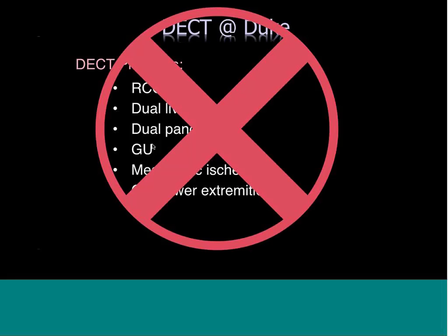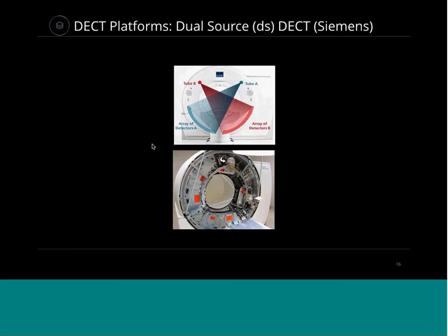My philosophy is, if you believe in dual energy CT, you better do it on everything. Either you believe it or you don't. Either it adds value or it doesn't. If it adds value in one phase, why wouldn't it add value in the portal venous in the delayed phase? So our advantage at Stanford is we do dual energy CT in every single phase, arterial, portal venous, even the renal delays. And there are clinical and research applications for doing so. And everything we do isn't just to do it for the purpose of doing it. It has downstream effects, clinical care and research applications. Okay, so I might not be able to articulate all those points today given our time limitation, but that is true. So really quickly, just a little bit about both vendors.